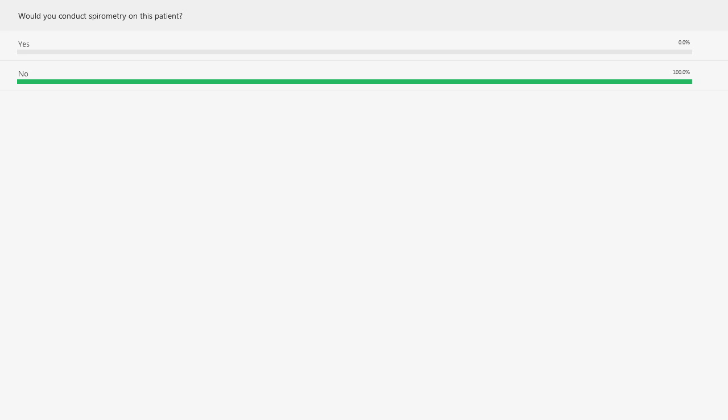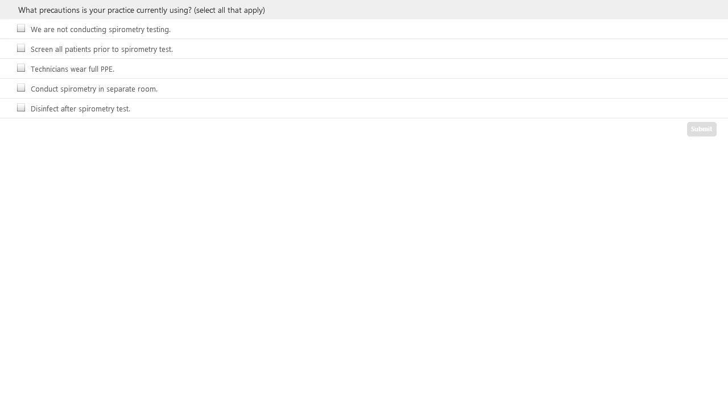Thank you, Ed. We're going to have another poll of all of our participants. What precautions is your practice currently using? You can select all that apply when you're conducting spirometry testing. Do you screen all patients prior to a spirometry test? Do your technicians wear full PPE? Do you conduct spirometry in a separate room? Do you disinfect after a spirometry test? Please select all that apply. And let's go ahead and see what our participants answer to this question.